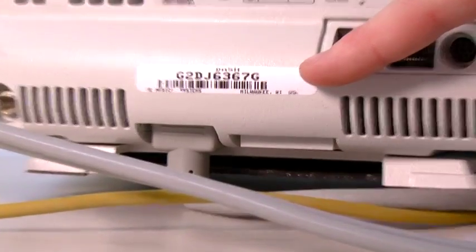And then your next thing you would do is a very simple visual inspection, which basically you look over the monitor a lot more in depth than I am right now. We've already done this one. And you look at all the cords. Just make sure obvious damage has not happened. Very simple things, but very, very important. And then your next thing you would do is to clean it thoroughly with the proper cleaning supplies, which we will go to in just a moment.